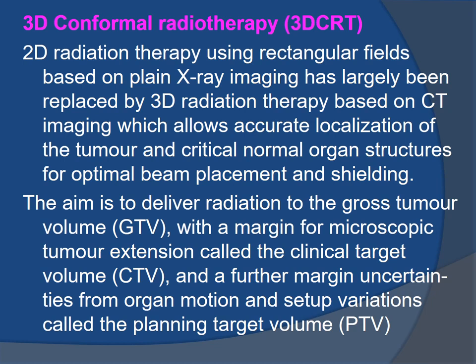We have many techniques for dealing with radiotherapy. These techniques may be 2D radiotherapy, 3D conformal radiotherapy, stereotactic radiotherapy, or intensity modulated radiotherapy, IMRT. 2D radiotherapy: in the past we used the 2D technique, but nowadays the 2D technique is used only in palliative conditions.